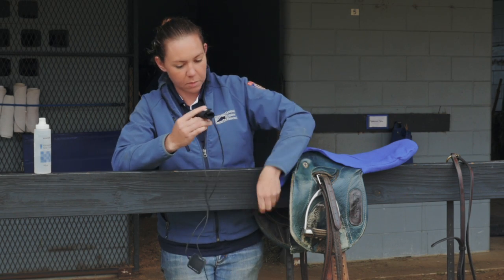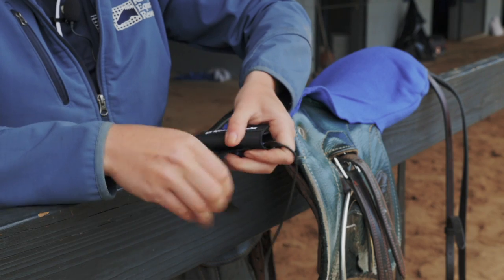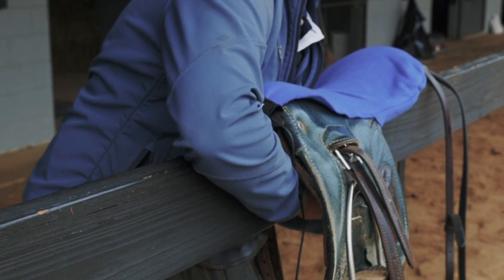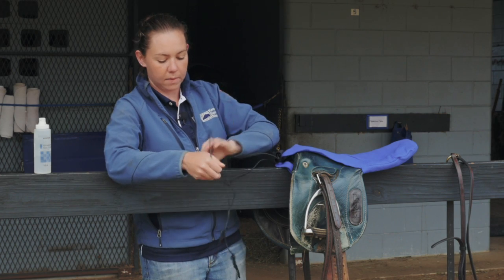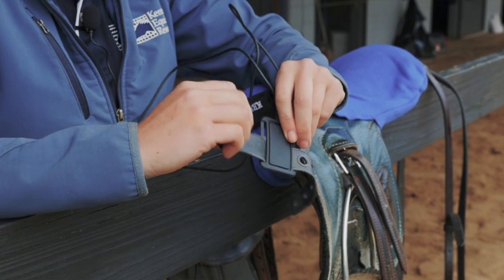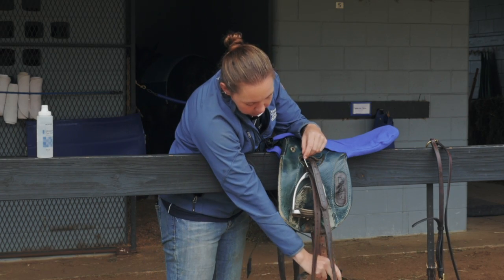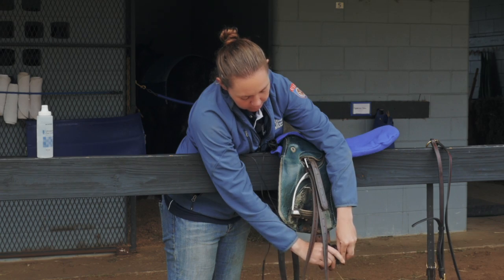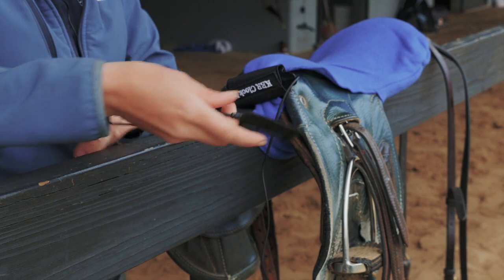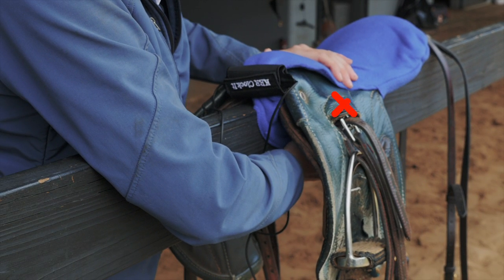You take the transmitter and put it on the saddle cover, the little strap in the back, and connect it underneath. Then you have the longer electrode here with the strap on the back, and this will go on the girth down here underneath. You wrap this around the back, and then you have the shorter electrode, which is going to go under the saddle up this way, and it will sit right about here under the saddle.